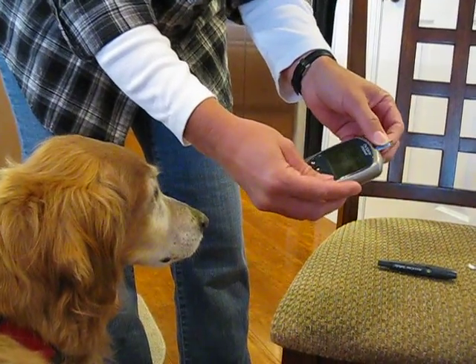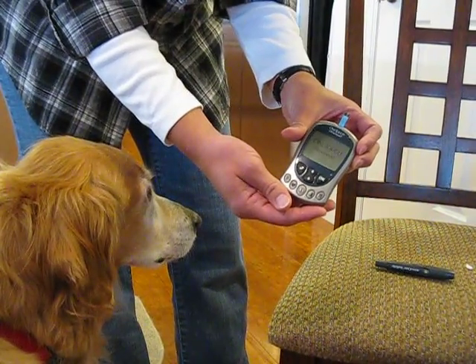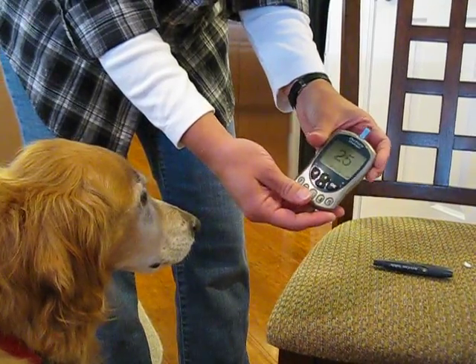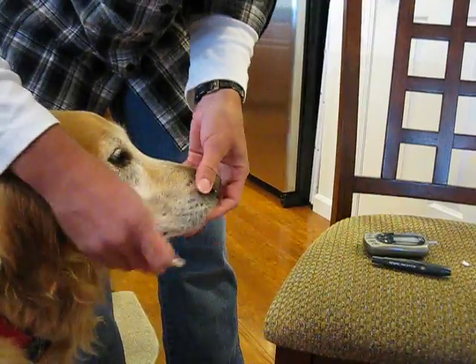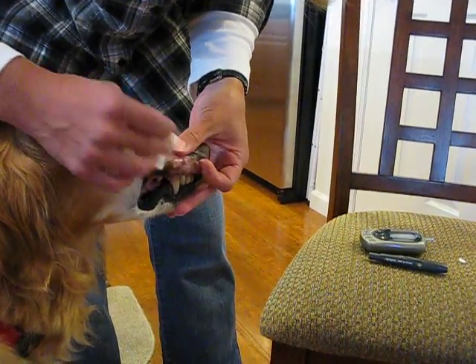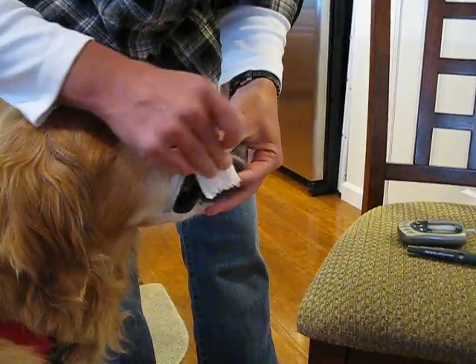I put my strip in the meter so it's all ready. I like to stand over Allie because it gives me a better angle. I lift up on her lip and use a damp paper towel just to dry it off.